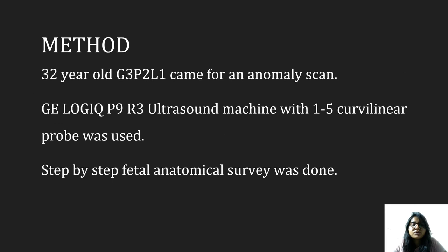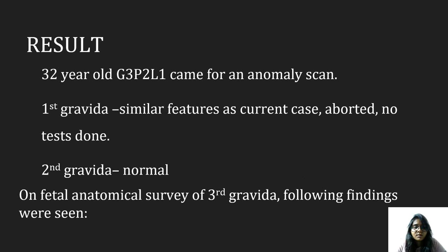A 32-year-old G3P2L1 came for an anomaly scan. A GE Logic P9R3 ultrasound machine with curvilinear probe was used, and a step-by-step fetal anatomical survey was done. In the 1st gravida, findings were similar to the current case, which was aborted and no tests were done. The 2nd gravida was normal. On anatomical survey of the 3rd gravida, the following findings were seen.